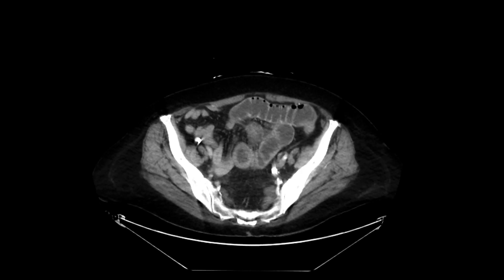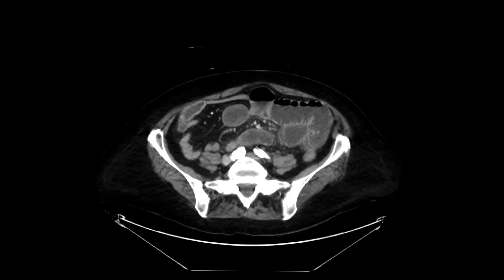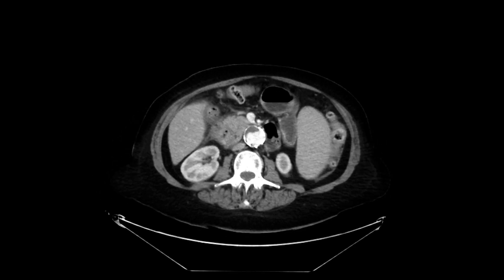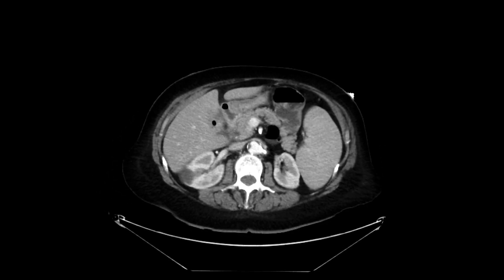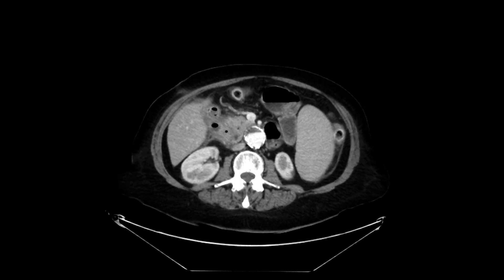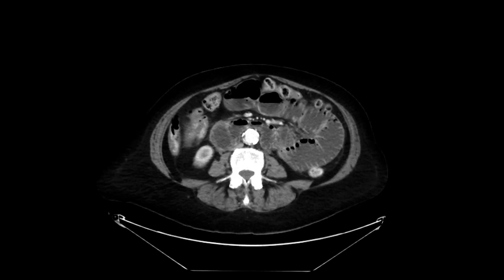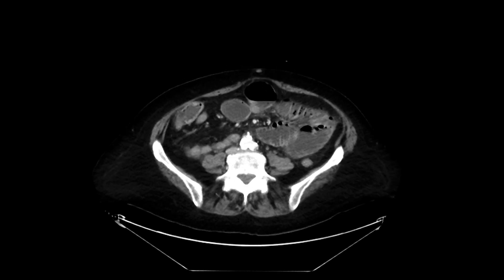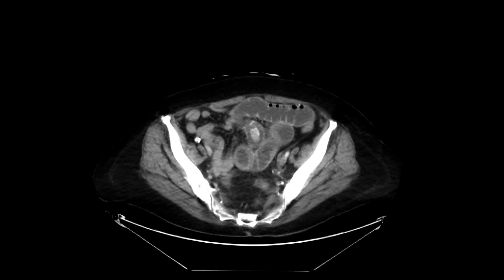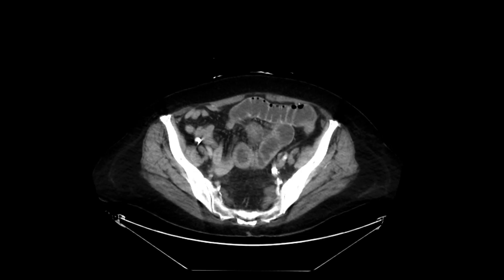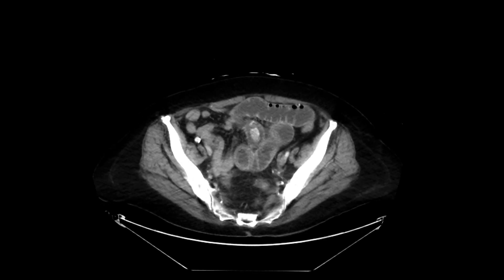And beyond that, loops are underdistended. Putting all these findings together, it looks like there is some inflammatory change involving the gallbladder with a tract from the gallbladder to the duodenum. This results in a small bowel obstruction due to the presence of a gallstone. This is a classic case of gallstone ileus.